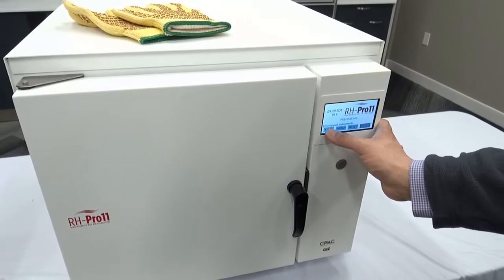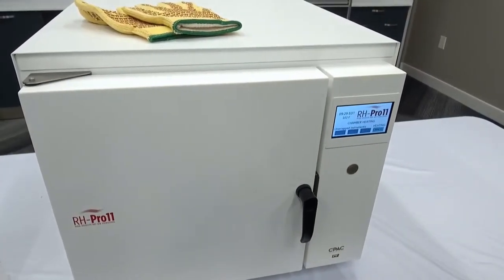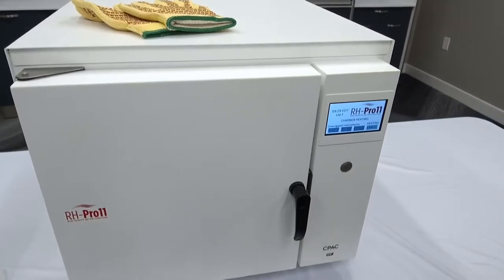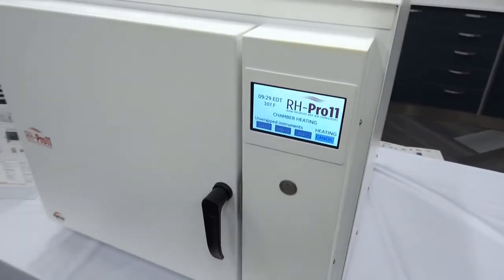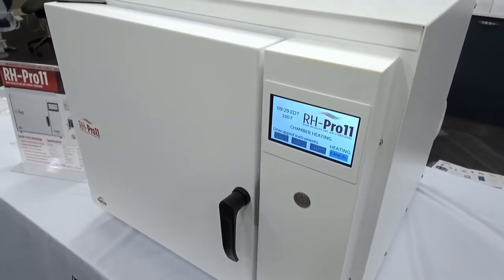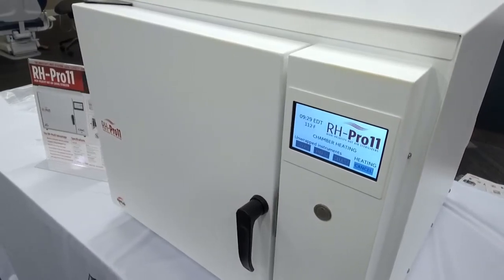The most important part of what this unit has to offer for your office is its 6 to 12 minute turn time — 6 minutes unwrapped, 12 minutes wrapped, with a 4 minute cool down period. Maximum time is going to be 20 minutes. Automatically in the morning, as soon as you turn on the unit, it does preheat.